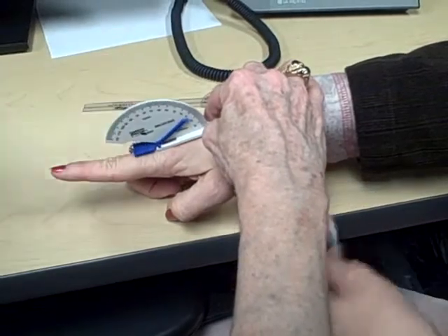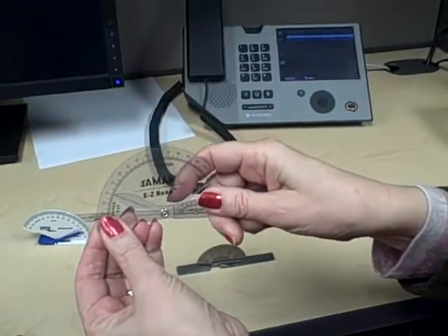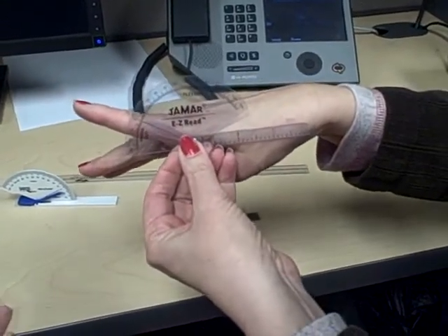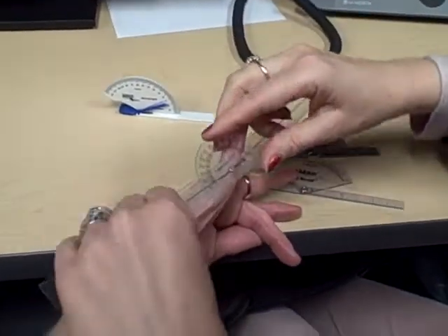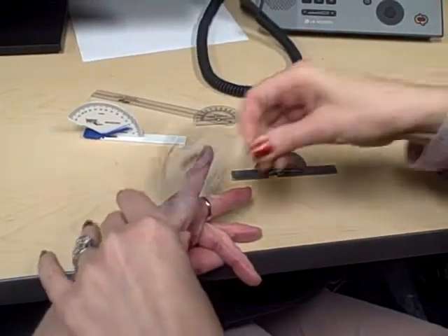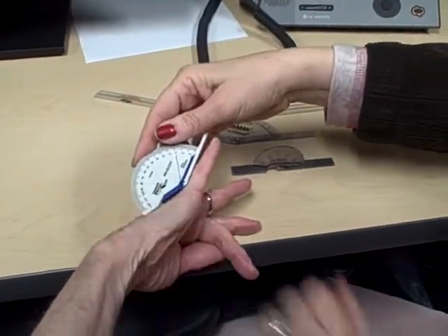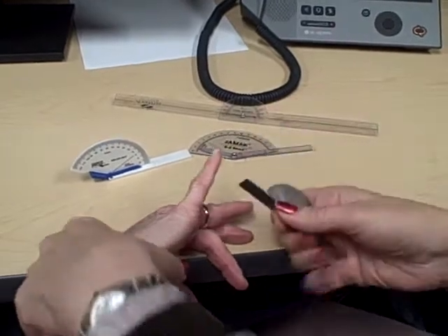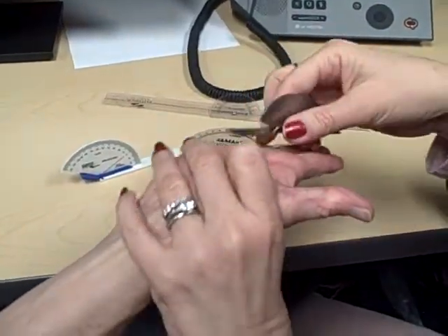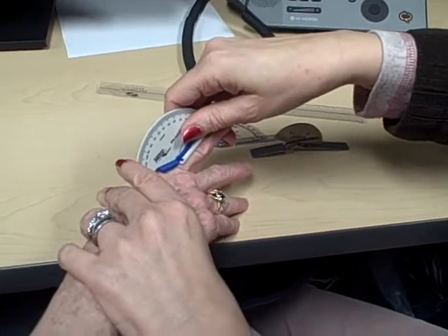With a flat goniometer, it doesn't work on top because the surface is flat — it only works if positioned alongside the finger. If we had some hyperextension at the little finger, you'd have to lay the flat one on the side. But with these cutout goniometers, you can have it right there on top of the finger. If you only have a flat goniometer and want to measure hyperextension, you would have to go from the palmar surface. But when you have these with the cutout, you're able to measure hyperextension from the dorsal surface.